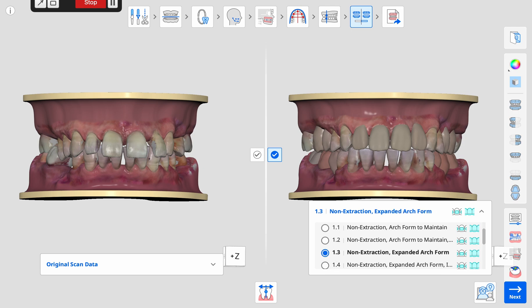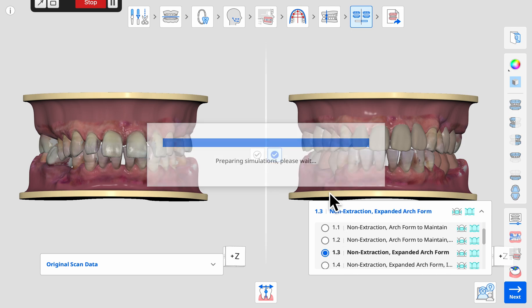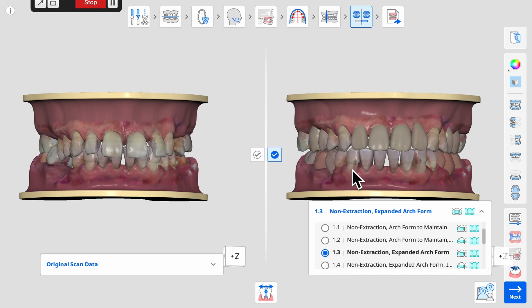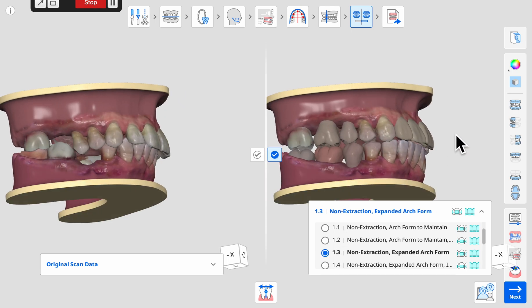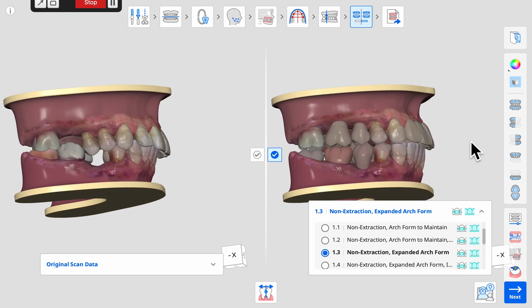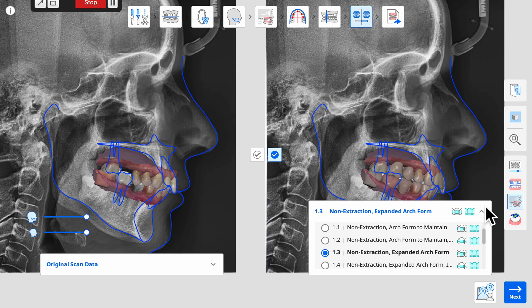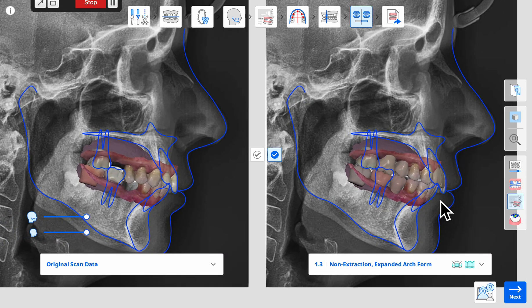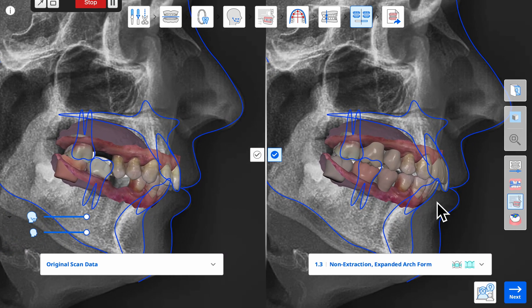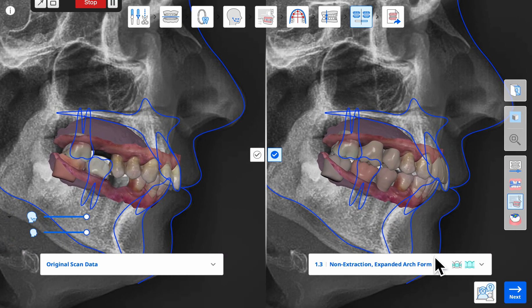For example, if we select a simulation with planned expansion as demonstrated here, we can easily visualize the difference in the final positions of the incisors when overlaid on the lateral CEPH.